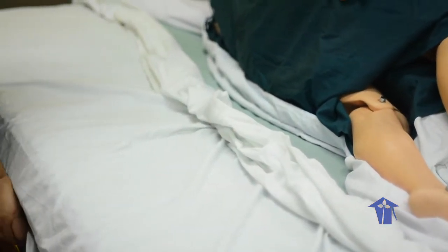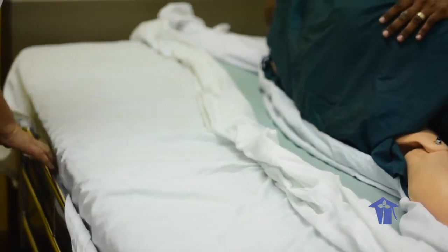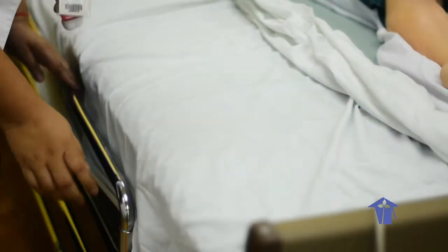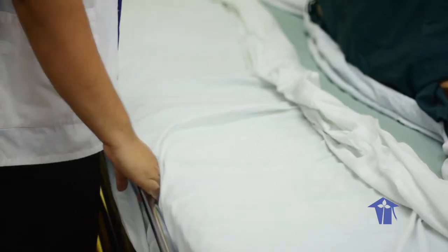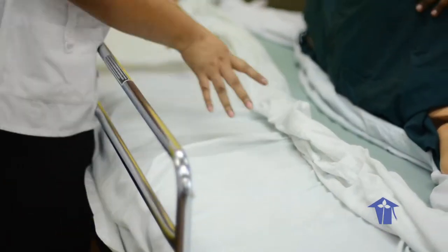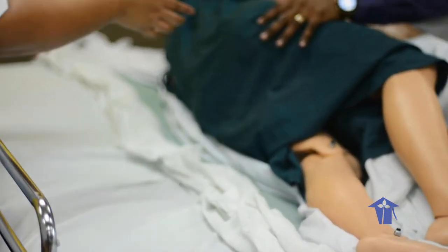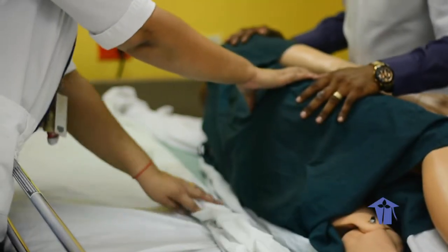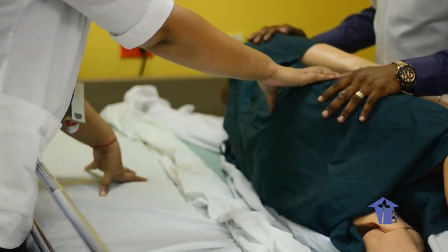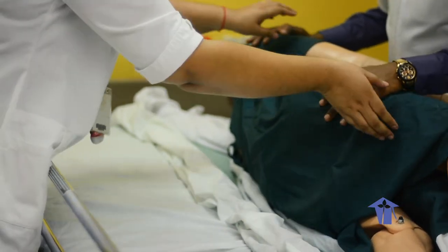Good. Are you okay, Miss Jane? Yes, I am. Good. We're not going to be too long, all right? So because she's going to come back over to me, I'm going to raise my side rail, and we're going to roll her back over. Miss Jane, you're going to feel a little bump to your back, but we're just going to roll you back to my side, okay? So first we're going to bring her flat.